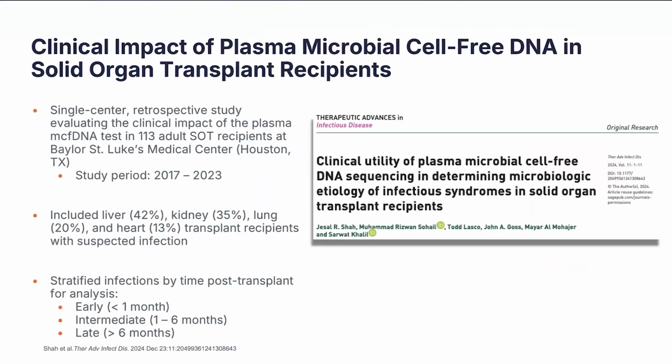And that's where the importance of this study that was led by Dr. Khalil comes in, and let her talk about it. All right. So, this data is from our experience of using Karius in our SOT patients, and we looked at 113 adult recipients who were hospitalized between 2017 and 2023.